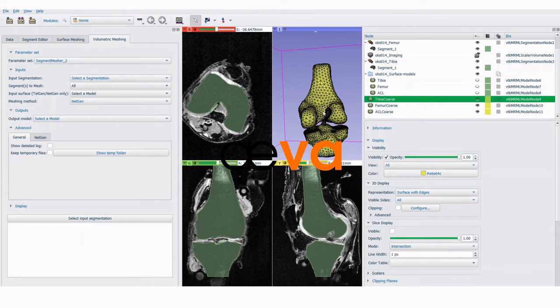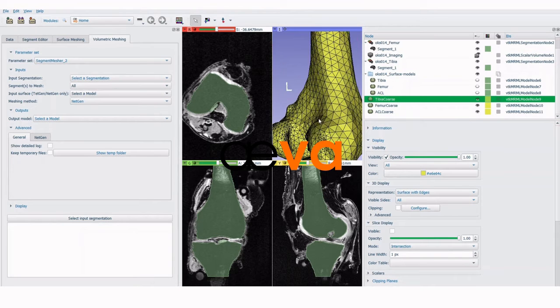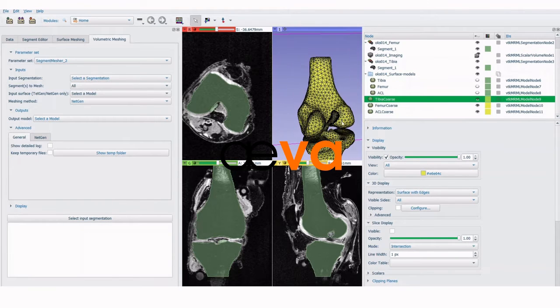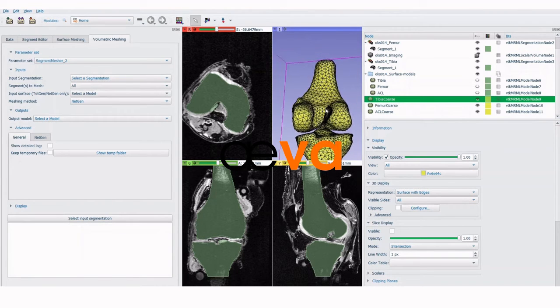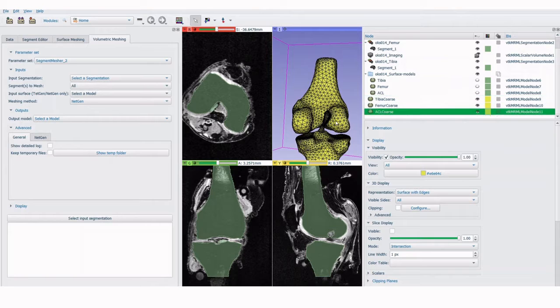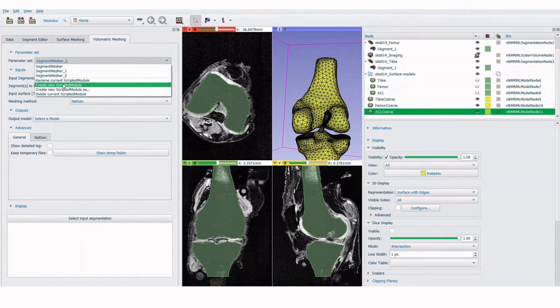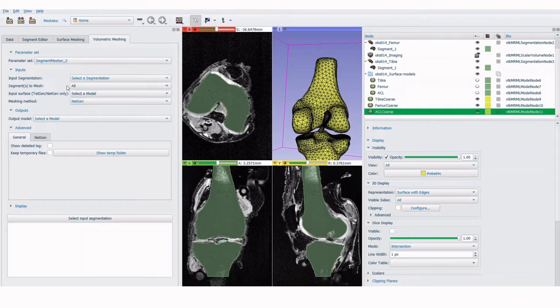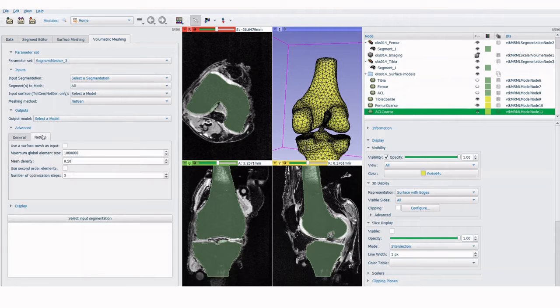In this video we will show how to turn a two-dimensional surface into a three-dimensional mesh using AvaSlicer. For this tutorial we start with coarse representations of a femur, tibia, and ACL model. See the surface meshing tutorial for a guide on generating these models.